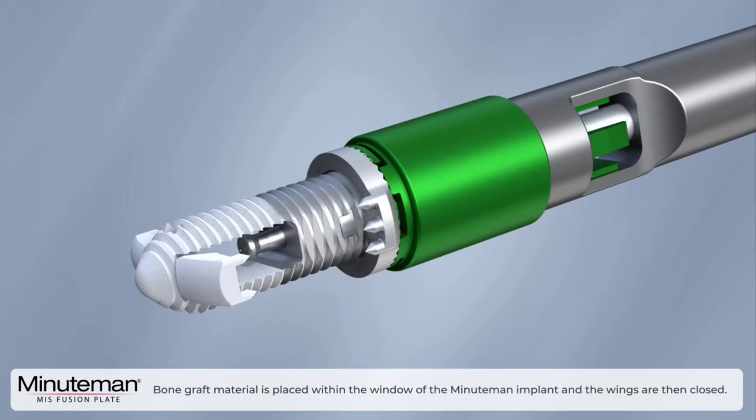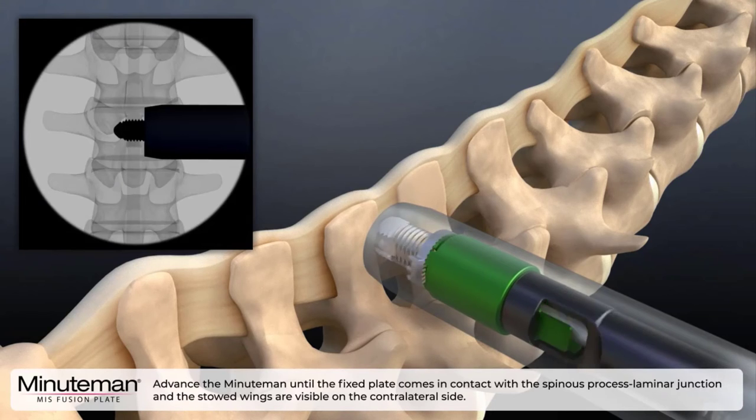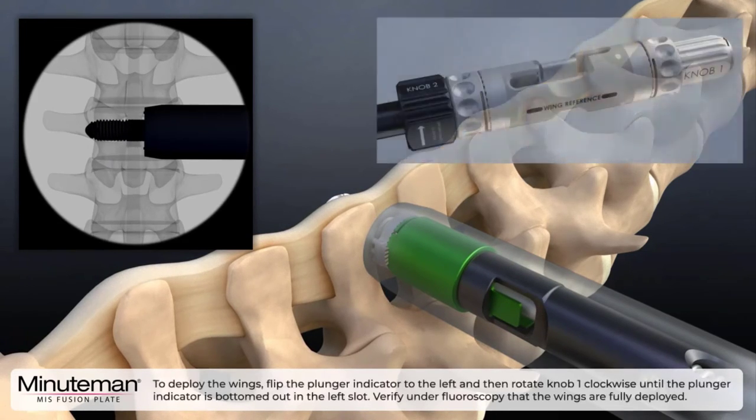Bone graft material is then placed within the window of the Minuteman implant and the wings are then closed. The Minuteman is threaded into the interspinous interlaminar space by rotating the G3 inserter clockwise while applying gentle lateral force. Advance the Minuteman until the fixed plate comes in contact with the spinous process laminar junction and the stowed wings are visible on the contralateral side.